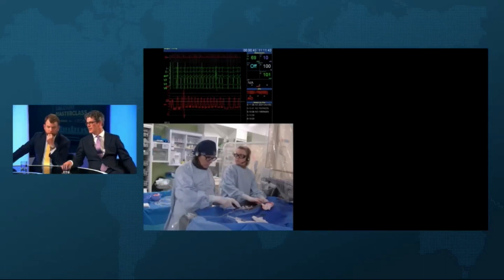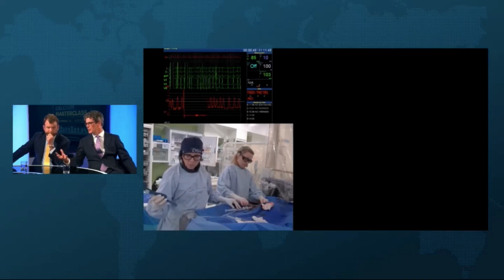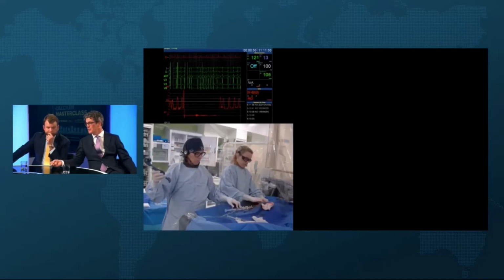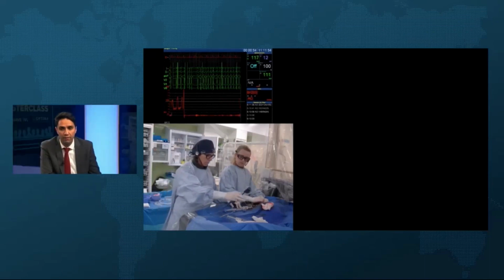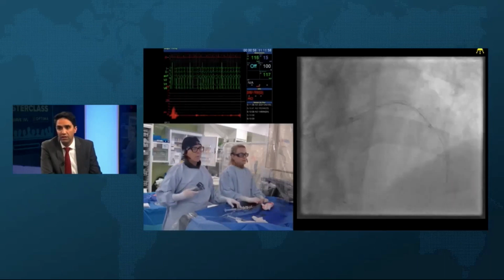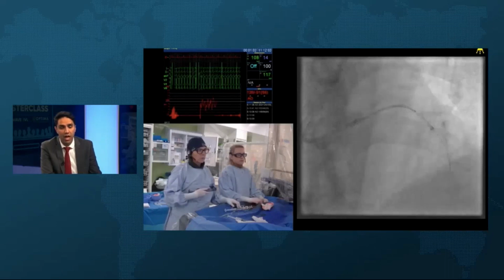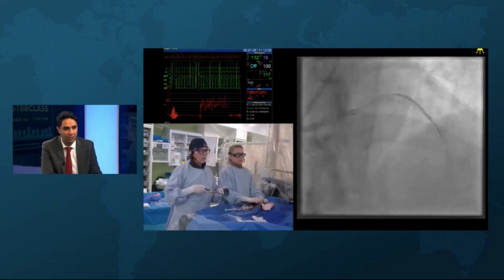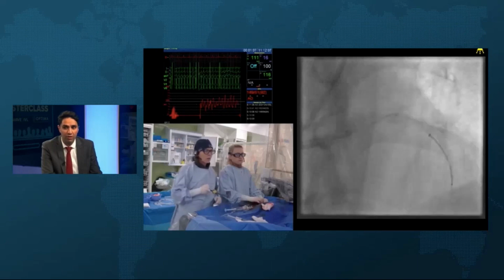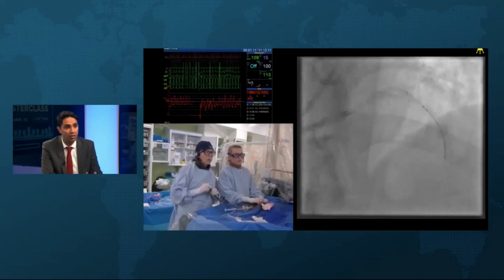You must have seen it, Ziad, in some of your OCT studies, that these fully expanded, fully treated nodules can, within a few months, sometimes grow back incredibly quickly. We actually published the 2-year data in JACC Interventions. I think it should be out either this week or next. So eruptive calcified nodules have a 20% event rate at 2 years, and non-eruptive calcified nodules have about 5%. And the mechanism of failure is the reprotrusion of these eruptions that go through the stent struts.